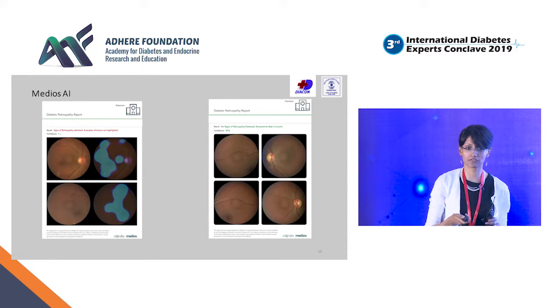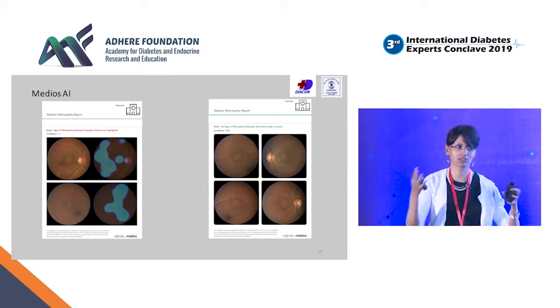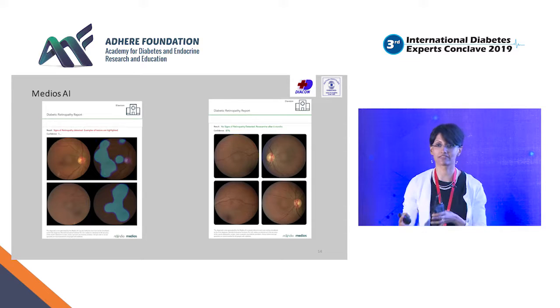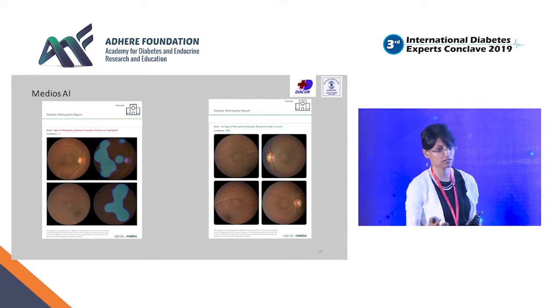So what it does for you is you're giving more overall comprehensive care. You're referring patients in a timely manner to the ophthalmologist when required, and there you're preventing blindness. The revenue part, I'll come right at the end because that was a part of the title of this symposium. So before that, let's look at evidence. So this is all fine, but to what extent do these algorithms actually work, and how accurate are they, because that's equally important for us as well.